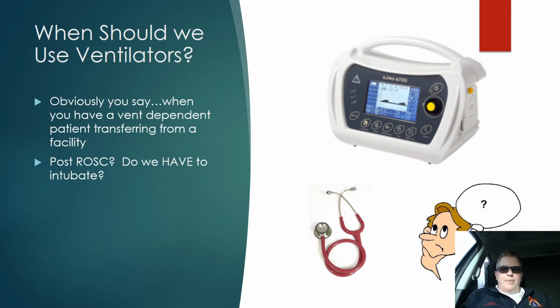We don't have PEEP on our bag valve masks. And what does that mean? It means that if we have a problem with our patients splinting open those alveoli and recruiting those alveoli and maintaining them open so that perfusion, ventilation, all of the respiration that happens in the alveolar capillaries, the gas exchange.